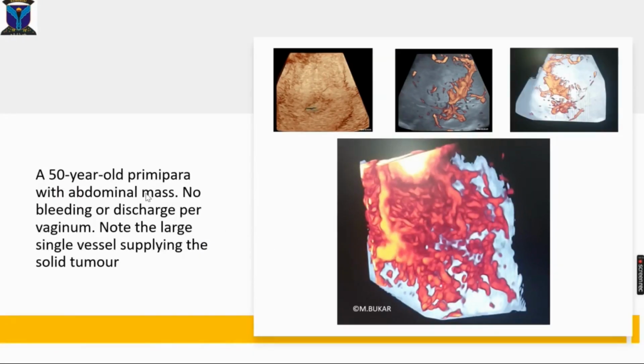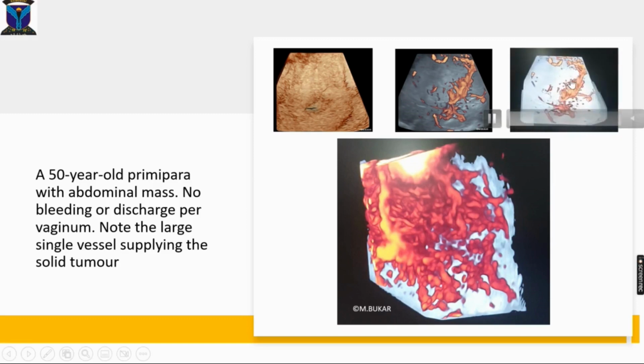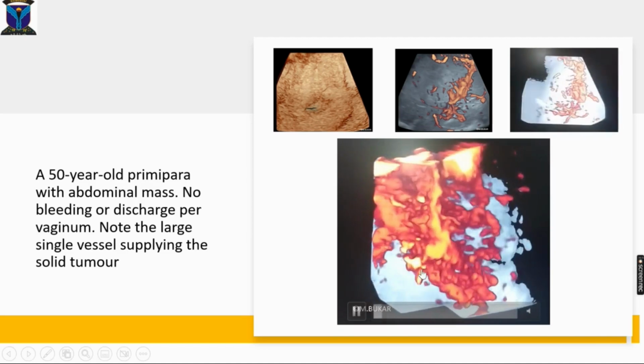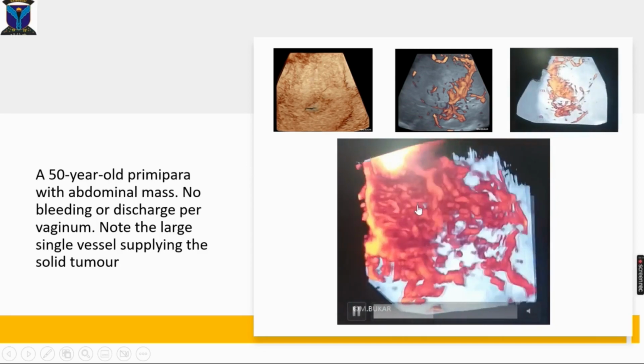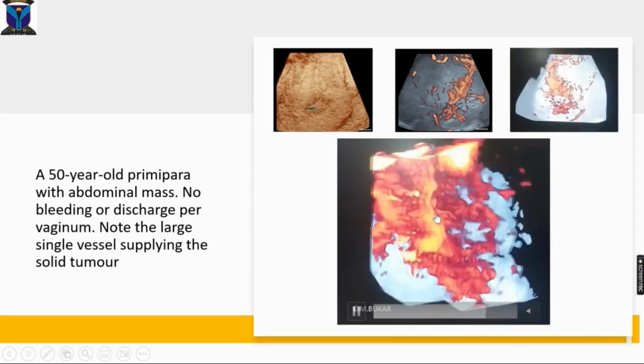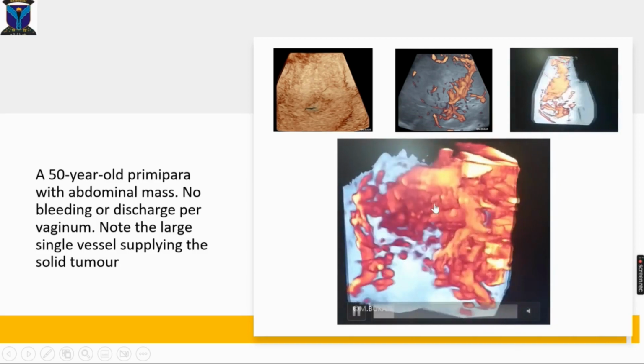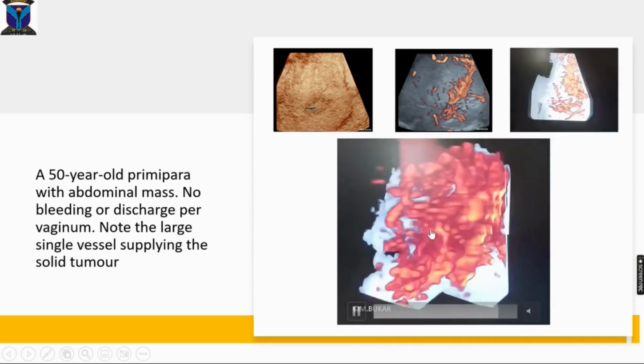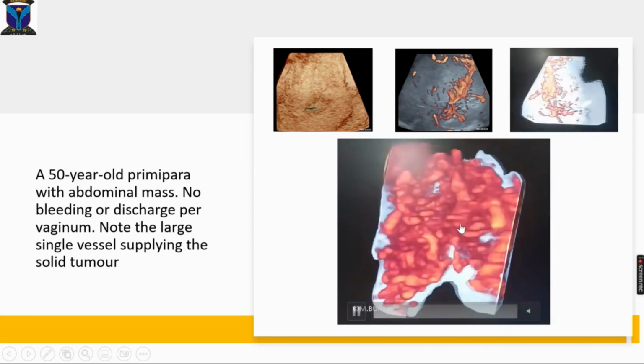This patient presented with an abdominal mass. It was discovered to be a solid ovarian lesion with this lead vessel as described by Antonia Testa. And look at the single loop of the lead vessel and the single loop of the blood flow to the other aspects of the lesion. Look at the features of malignancy clearly displayed here. Branching, looping, aneurysm, stenosis, bridging, everything. Unfortunately, this patient couldn't afford surgery and left against medical advice.